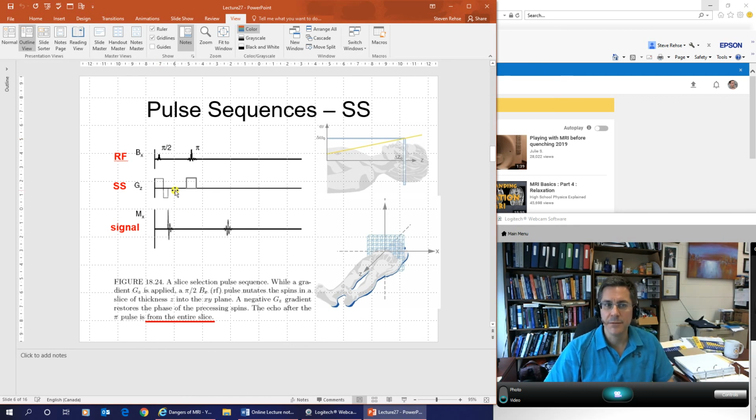All right, that's it. Now, we are looking for, this is the free induction signal right here. We don't want to measure that. We're waiting for the echo, right? The echo comes what? At what time? What time does the echo come after the pi/2 pulse? Say it out loud. You're alone. You won't embarrass anybody. Yeah, it's time TE, the echo time.